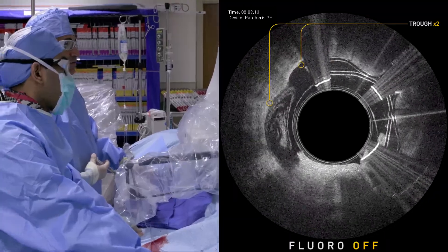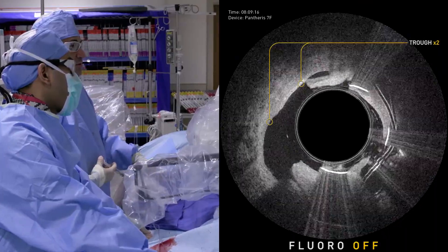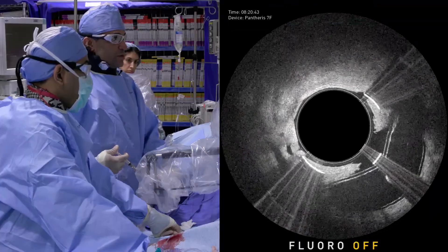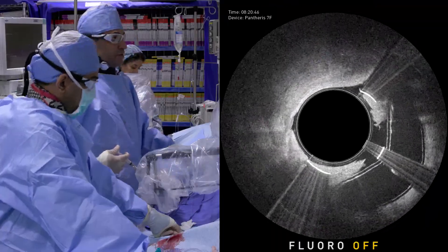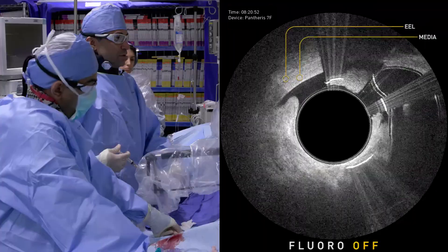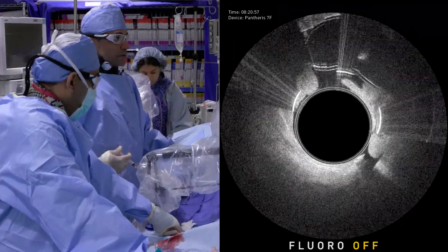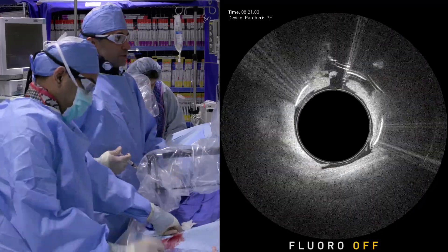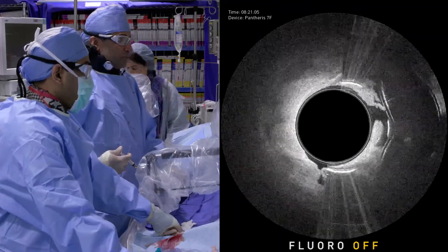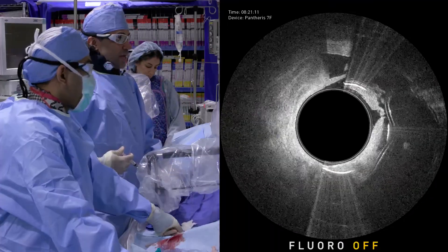And there's a trough right there. Balloon is down. See our trough? We're going to start with light balloon inflation. And then once you advance, then you can start digging in with a little bit more balloon. It's just something you have to play with and get used to. It really gives you unprecedented control of your atherectomy. That's what it's all about with Pantheris. You can control the depth of your atherectomy. You can control the safety of your atherectomy.